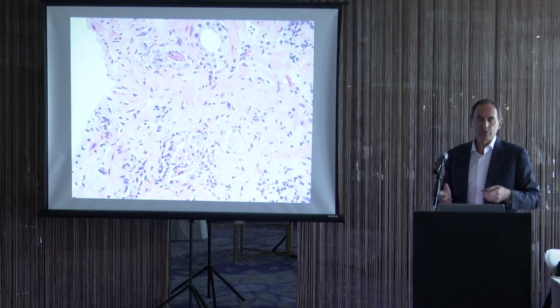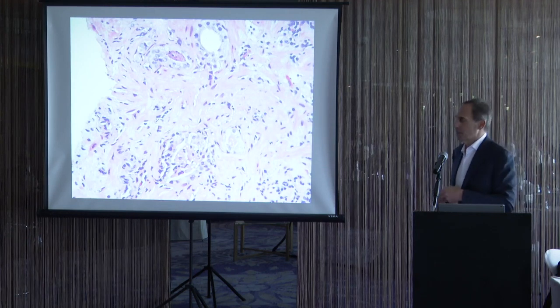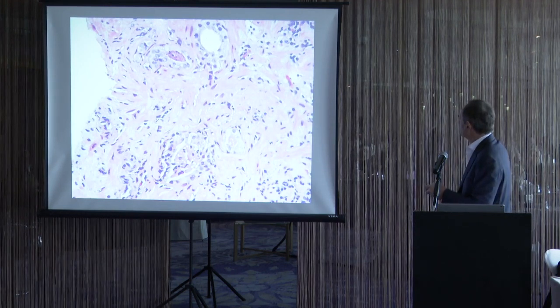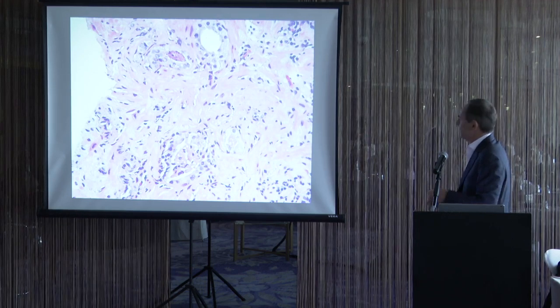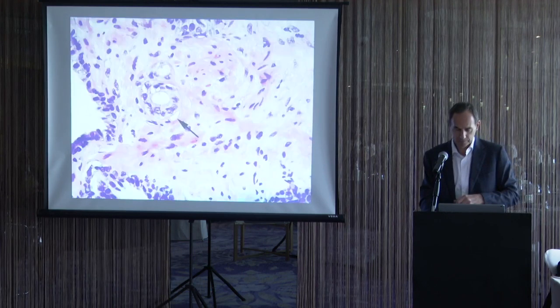Also, as I mentioned, with inflammation, you have to be careful calling cancer. So this focus here, there's some nucleoli, but again, inflammation can cause nucleoli. There's a few polys in here. I would call that atypical.